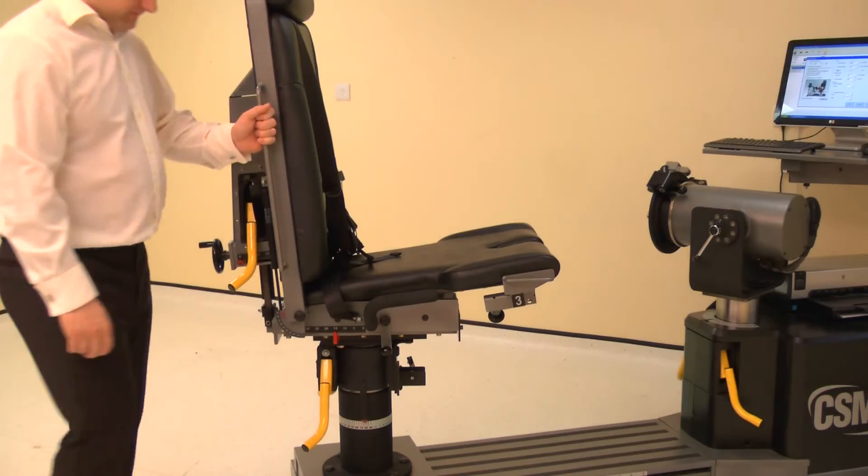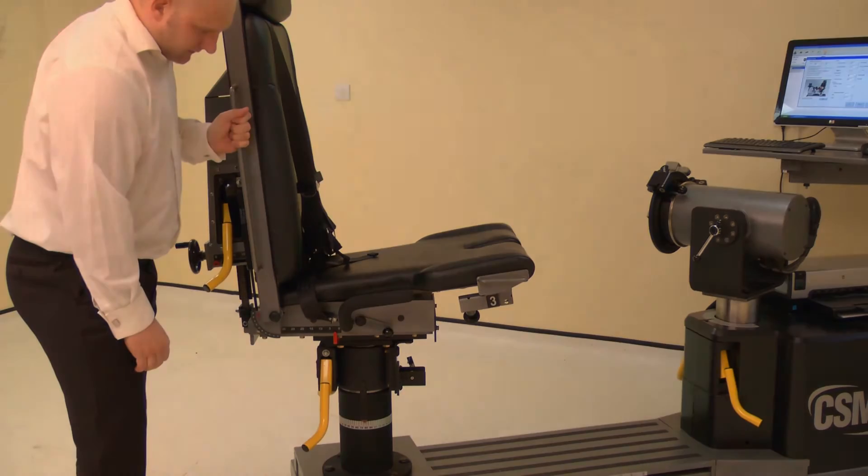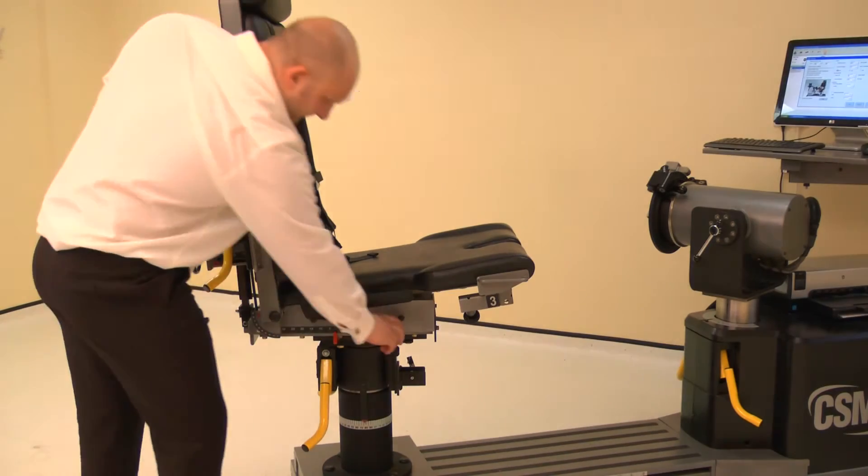The chair fore/aft is altered by raising either locking handle, then sliding the chair bottom forwards or backwards. Adjust the chair fore/aft to position 6. Lower the locking handle to secure.